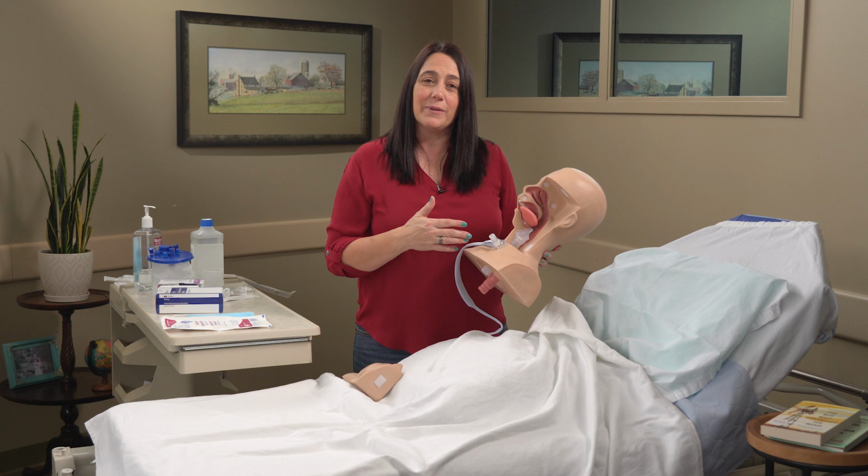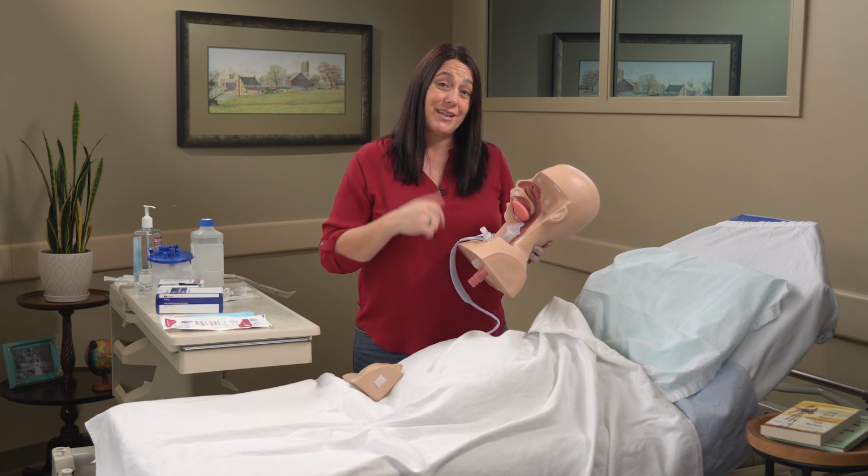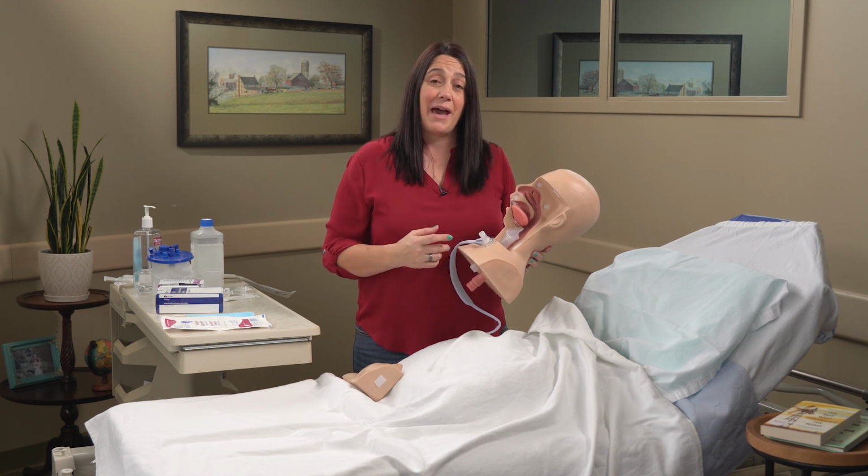If you're supporting someone with a tracheostomy, I don't want you to be afraid of it. I want you to realize that it is literally just a straw that's allowing them to breathe in and out just like the rest of us do. But the problem is, their body recognizes that that straw is not supposed to be in their airway, and the body gets mad about it. So then the body builds up mucus and other things to try to tell it to get out of there. You're not supposed to be here. So then this person ends up with a lot more mucus in their airway.